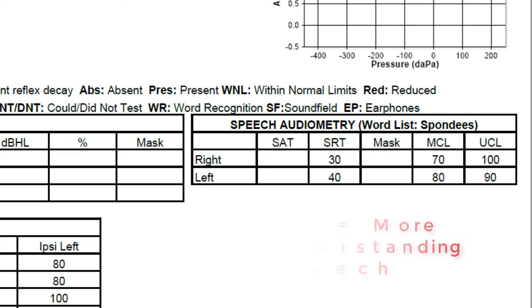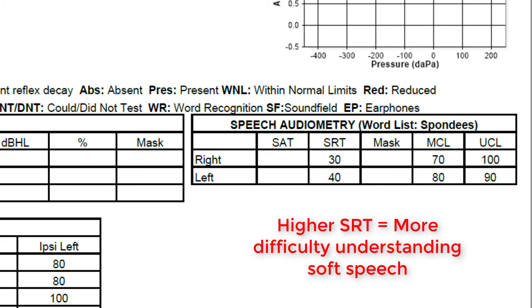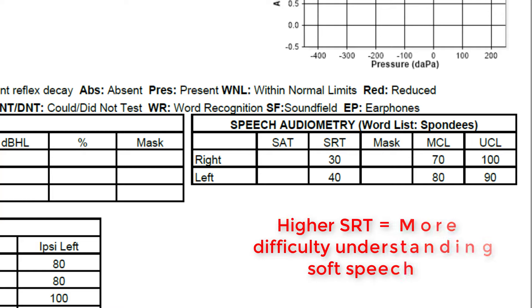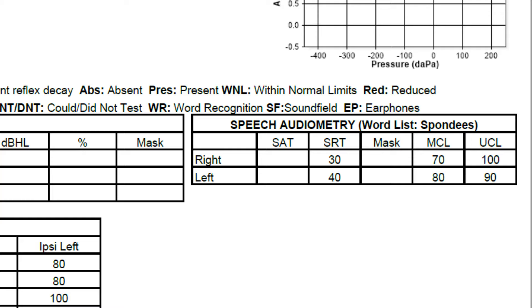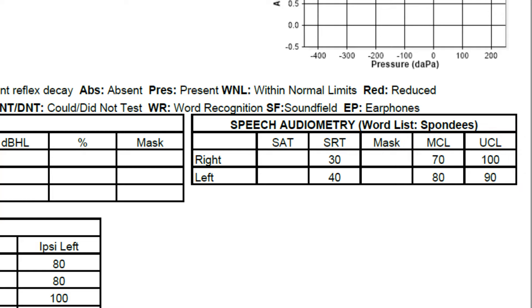Additionally, the higher the SRT, the higher the likelihood that you would have trouble understanding soft-spoken individuals. Inside of the speech audiometry section, you may also see most comfortable levels or MCLs and uncomfortable levels or UCLs indicated for speech instead of pure tone beeps. These are also indicated in decibels and can be used to help identify which decibel levels should be used to test your word recognition scores.